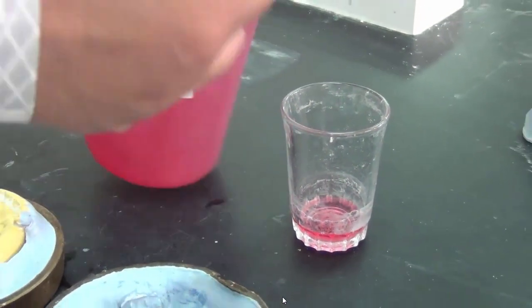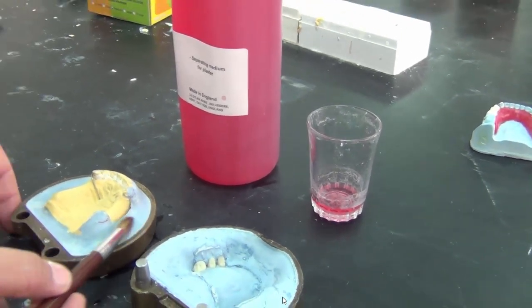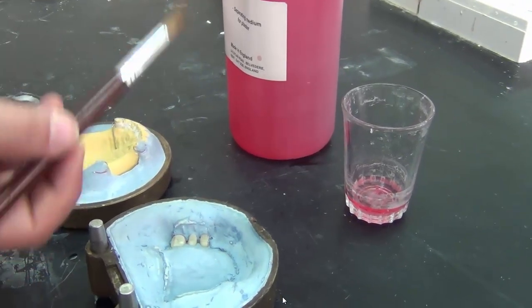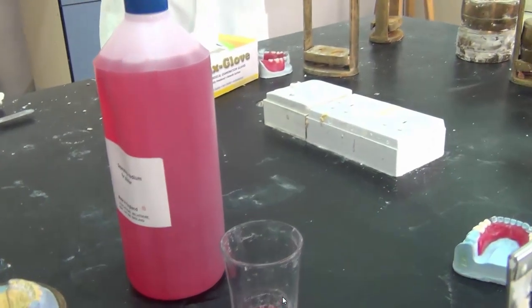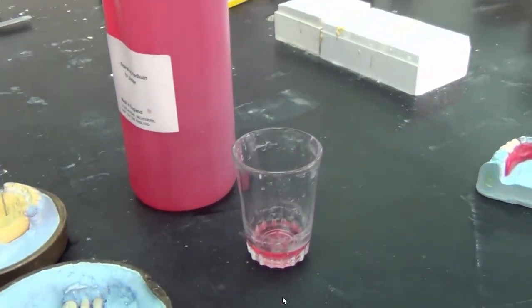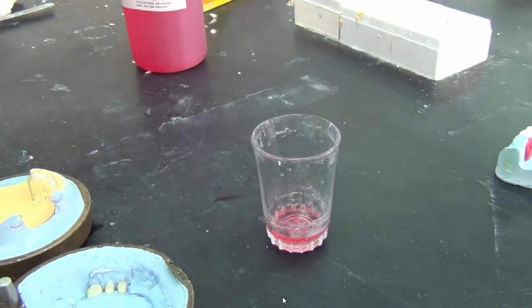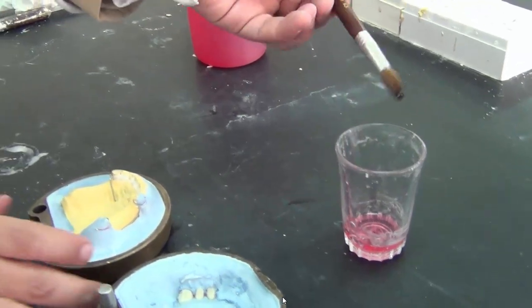We're not going to dip the brush into the main bottle because the brush, while in contact with stone and plaster, might pick up some calcium particles. So if these calcium particles go into the main container, it will set and gel altogether because of the presence of calcium. So we dispense it out into another small container, and with a brush we begin painting.